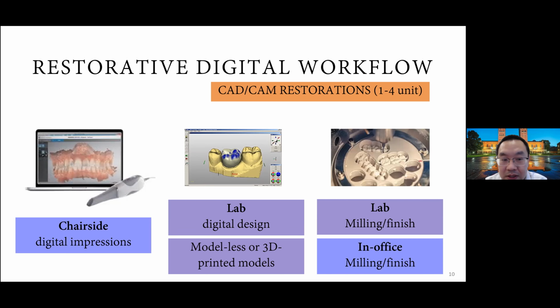But if you don't, to start off, I would say a lot of the labs are fairly capable of doing all this milling and designing for you, and also getting a 3D printed model. So you can start off by just adopting a traditional digital workflow, which doesn't involve same day delivery, but can still reduce the turnaround time from usually 3 weeks. You can cut it down to almost 1 week or 2 weeks. You of course have to communicate with your lab to set up how that is.